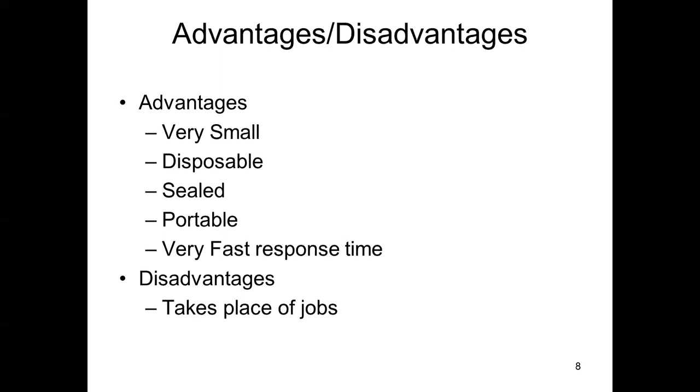It's interesting that in these types of units they would like to have only people that are medically proficient be able to view the results, so that they can make assertions to the next step of the patient's care. So for the most part, they don't like to release these for home use, so that people could buy these devices and then prescribe their own drugs, per se. The patients come in, these units are used to perform a task on a patient, and then that information is given to a physician that actually would take that data and apply the appropriate response.